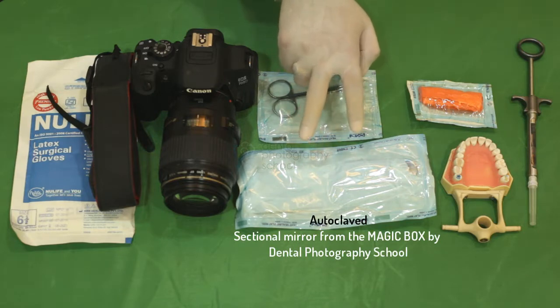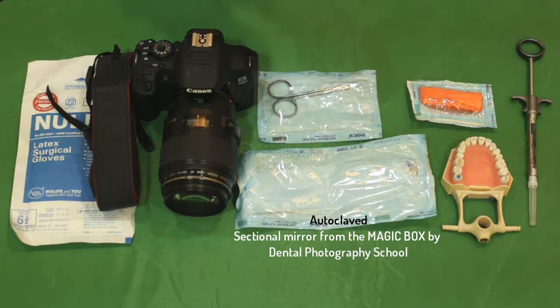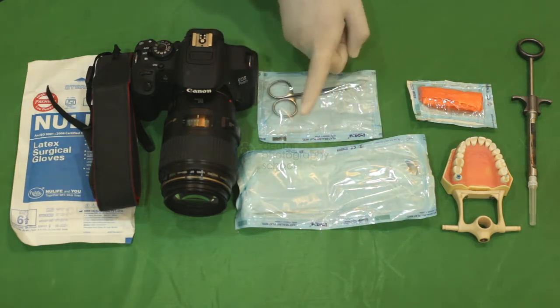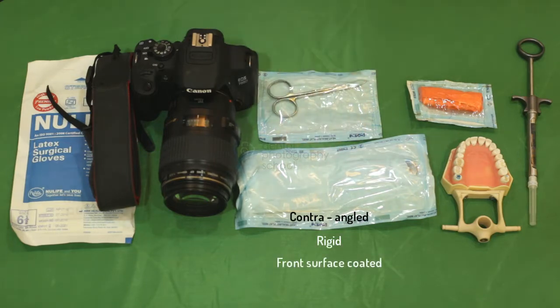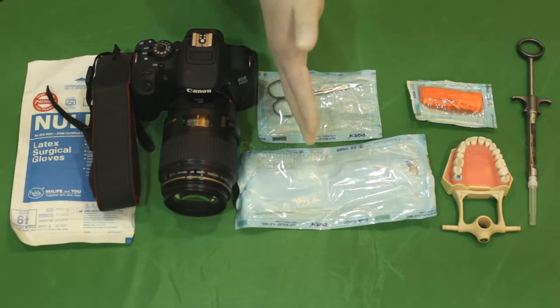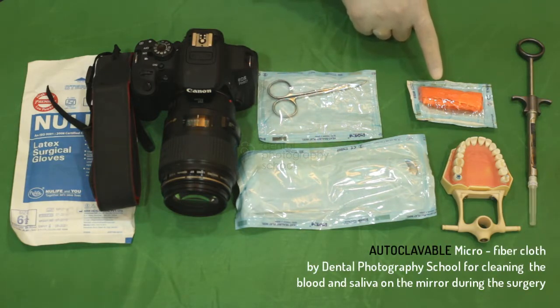A sectional mirror or a full arch mirror depending upon the area of your surgery. You need to keep in mind when selecting your mirror that the mirrors have to be contra-angled, rigid, as well as front surface coated. This is the reason why we are using the sectional mirror from the Magic Box by Dental Photography School.